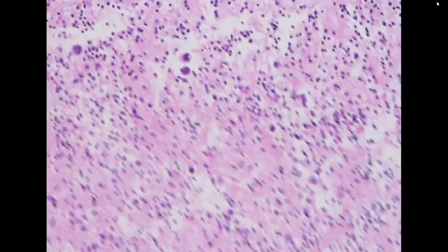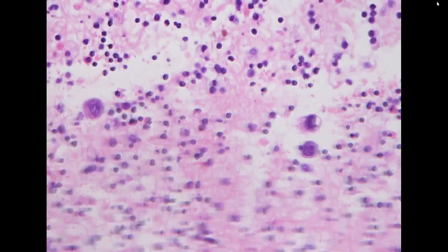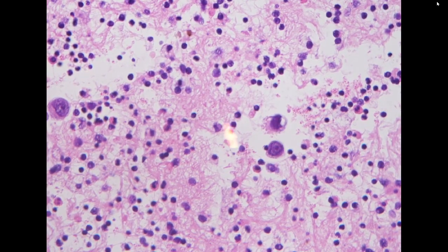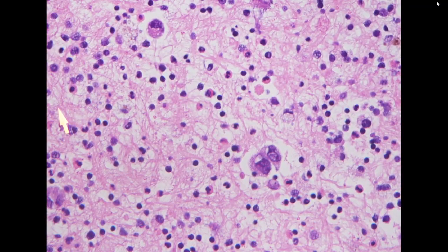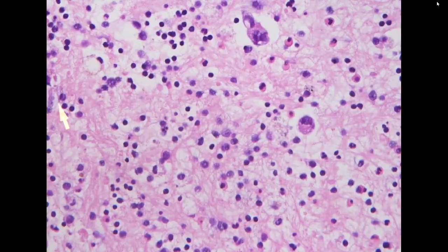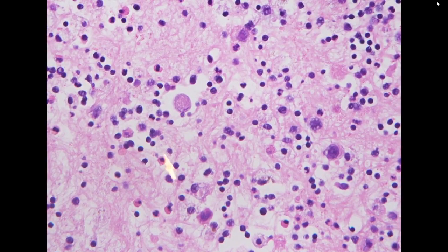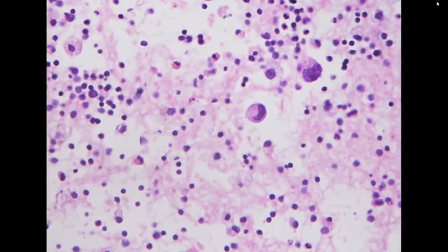So this is the cell block. Again, the percentage of tumor cells is very scant. So we can demonstrate the TTF1 expression by immunohistochemistry, but if we want to do EGFR molecular testing, the tumor percentage might be too low, because you see the majority of the cells in the background are lymphocytes, and the tumor cell percentage seems to be lower than 5%. So this is not optimal for molecular testing, and we need to address that in our report.